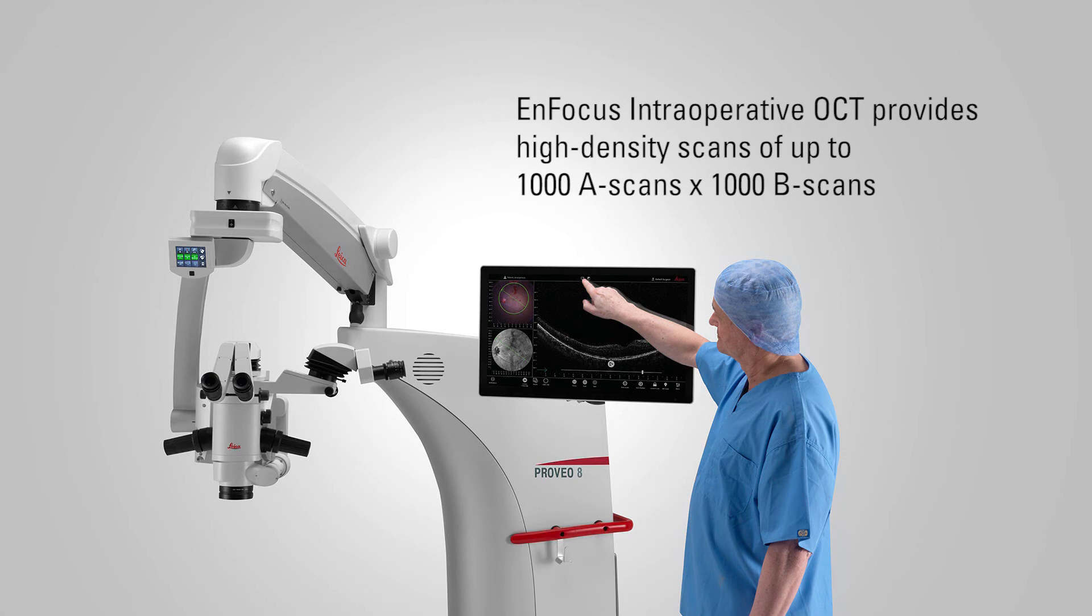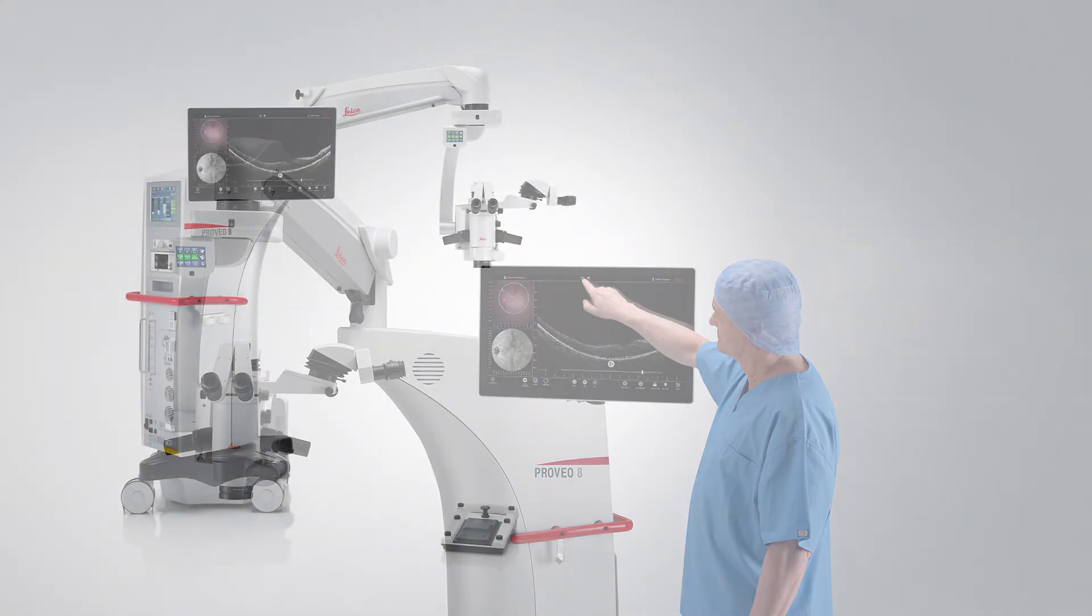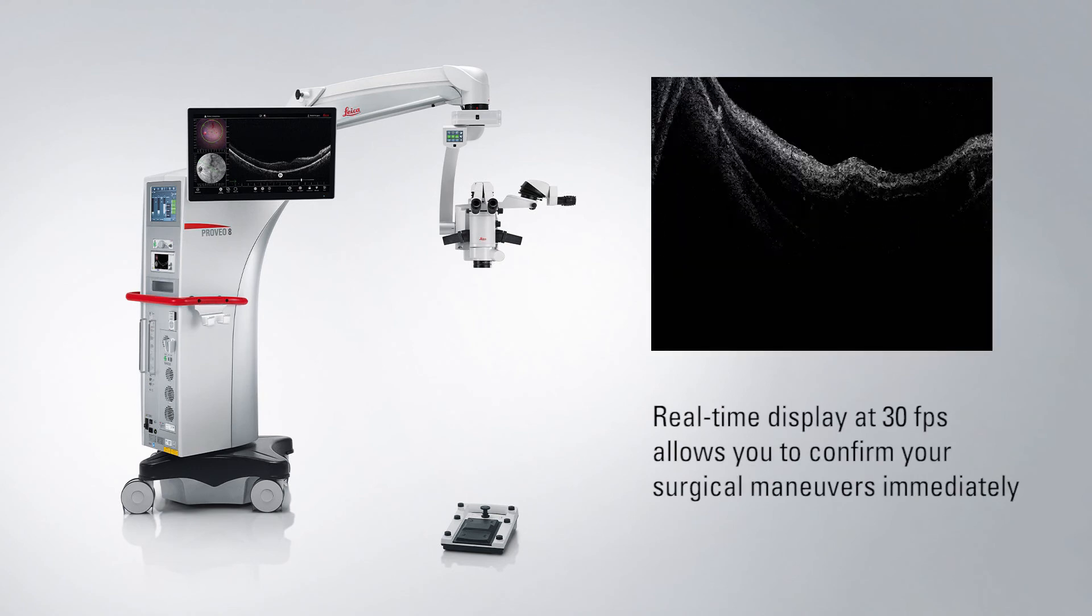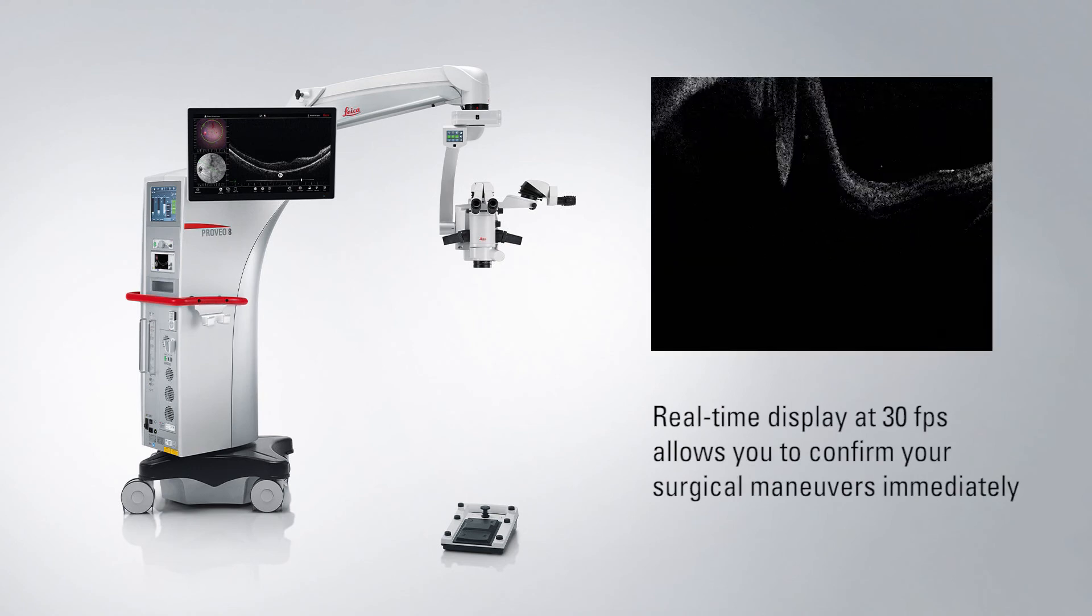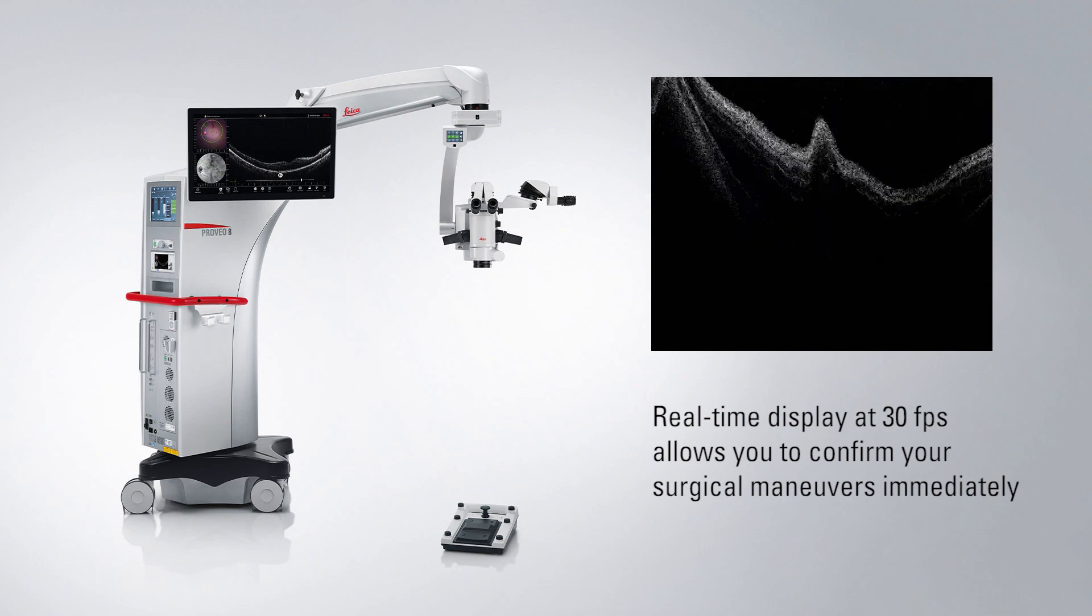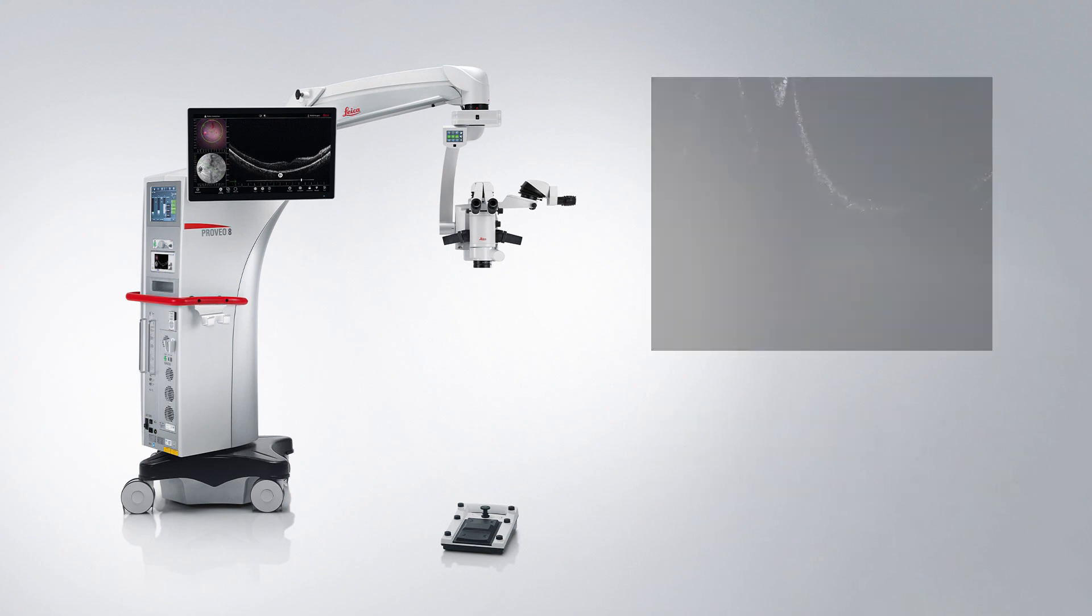The Infocus HD OCT provides high resolution images that demonstrate the tractional effects on the retina and the surgical planes for membrane peeling. Real-time OCT scanning can monitor for stress on the retina during membrane peeling and confirm the adequacy of membrane removal to reach a surgical endpoint.